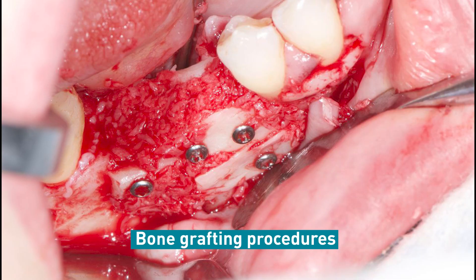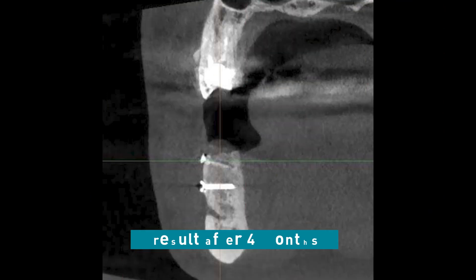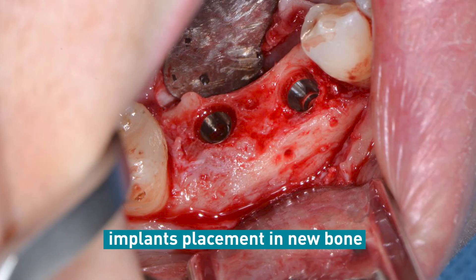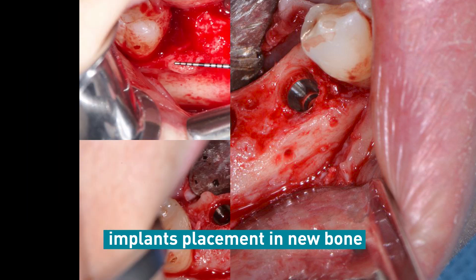The next picture shows the result of bone grafting and placement of an implant in the new bone. I would like to draw your attention to the fact that we used only autogenous bone for bone grafting, according to the Professor Curie approach.